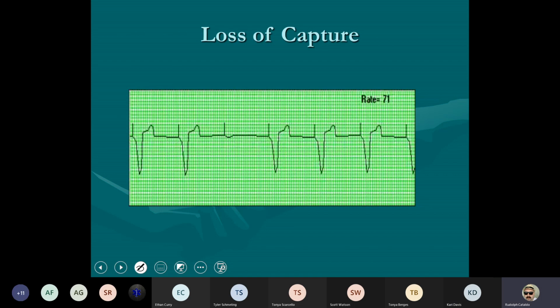We used to use this giant magnet that would literally go over the patient's pacemaker, and it would reset it. You held it on there for about 5 seconds, and then you took the magnet off. It reset their pacemaker back to manufacturer standards, and then you'd watch to see if the pacemaker started working appropriately. If it didn't, you left the magnet over their pacemaker and shut it off. Well, if I shut off their pacemaker, I can just put my pads on and start pacing them. If their pacemaker fails, you still have fail-safes on how you can treat this patient.